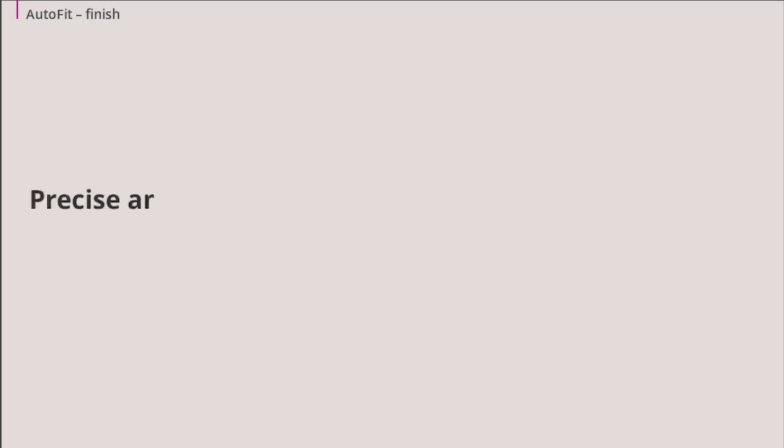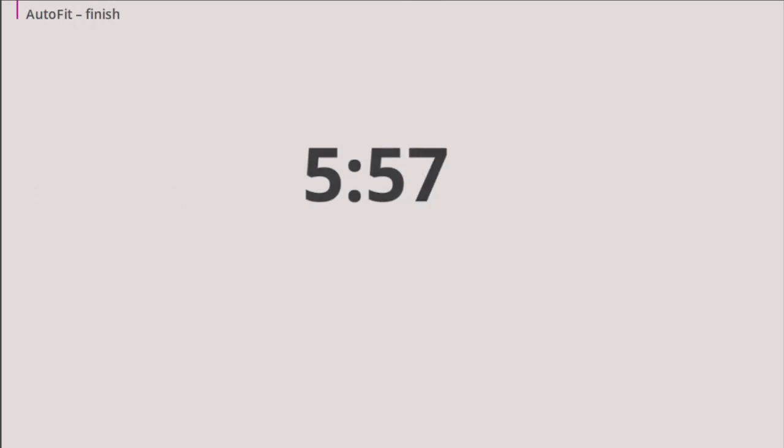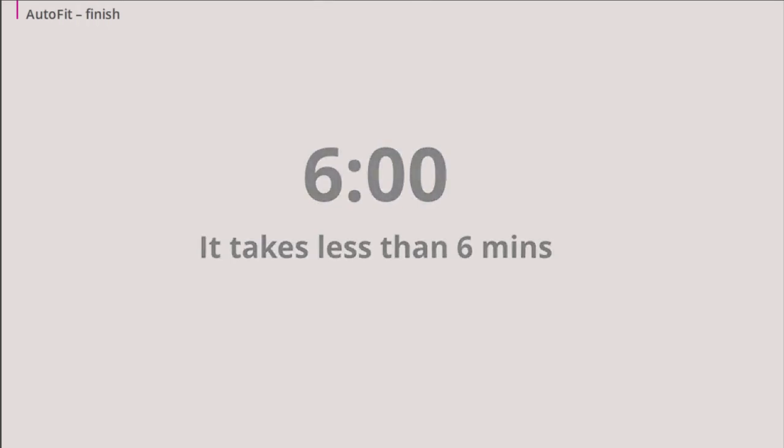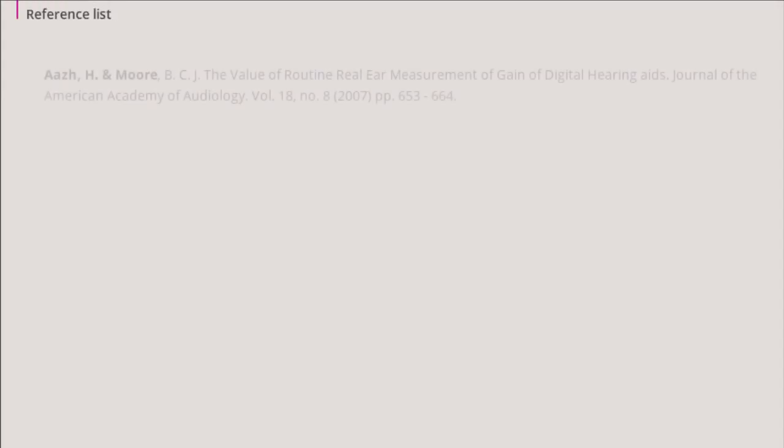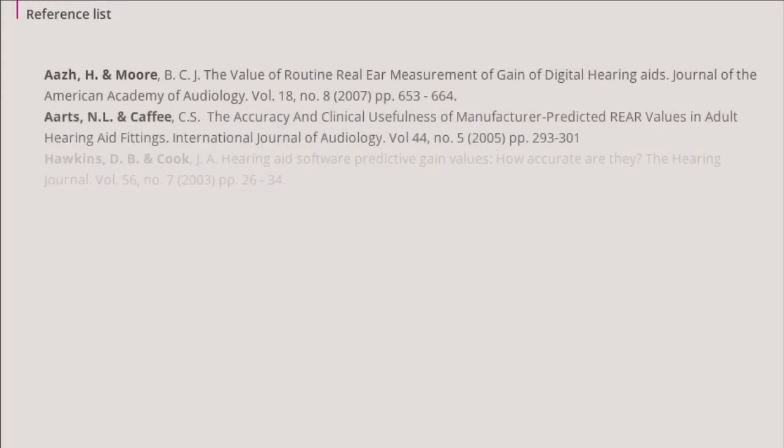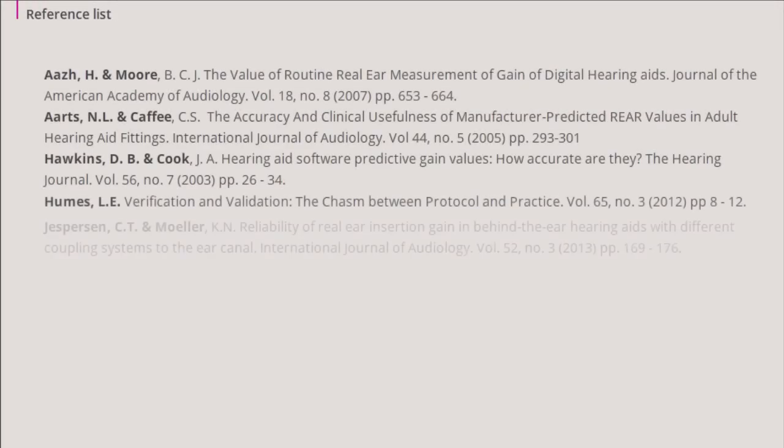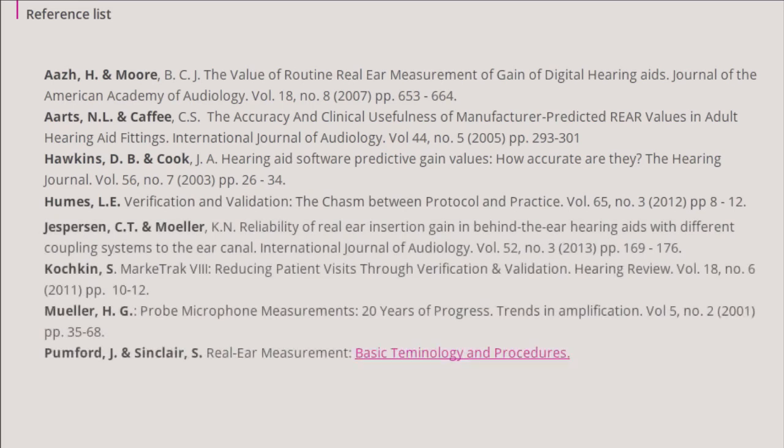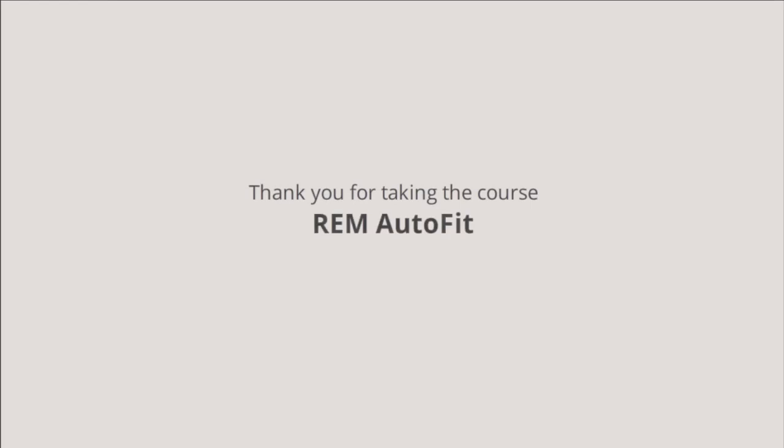By using the REM AutoFit tool, you will get a more precise and individual fitting, which saves time in the clinic. Actually, you can perform a REM AutoFit measurement in under 6 minutes. For further information on real ear measurements, please refer to the reference list. Thank you for your time.